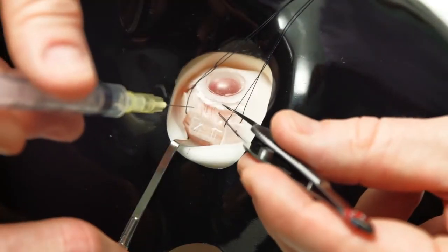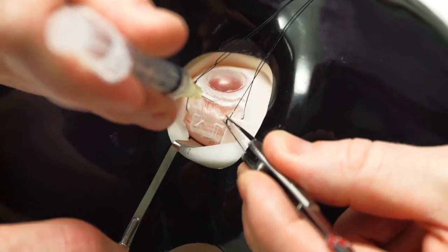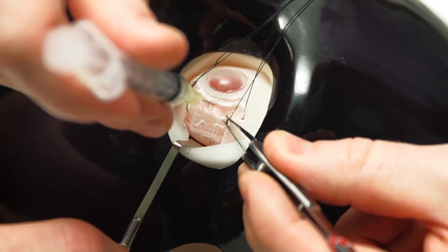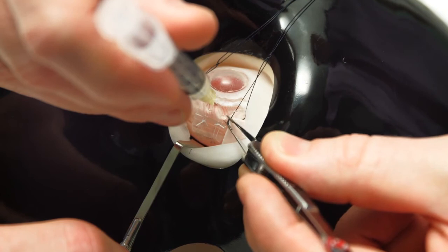It should be checked before releasing the pressure whether any bleeding has occurred. We're also showing here how a gas injection can be given into the eye via the pars plana and a 30-gauge needle.